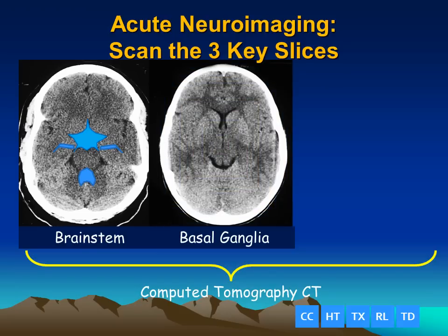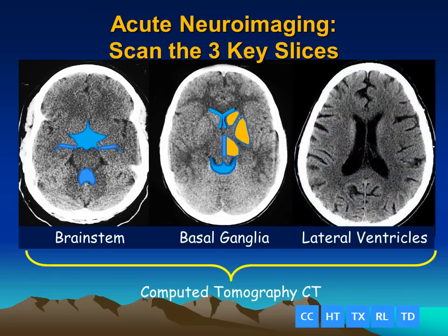At the level of the basal ganglia, we have the frontal horns, the third ventricle, and the smile shape of the quadrigeminal plate cistern. We can also see the gray matter of the head of the caudate nucleus, the lenticular nuclei, and on either side of the third ventricle, we have the thalamus.